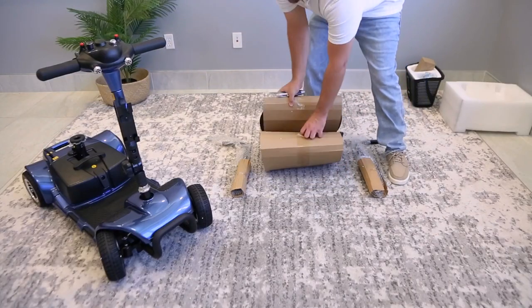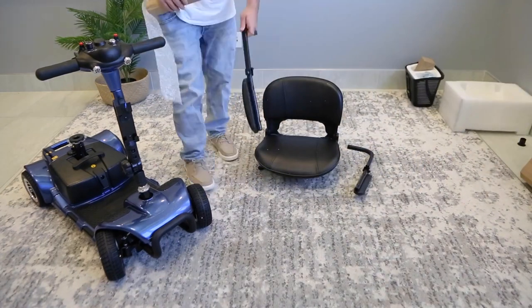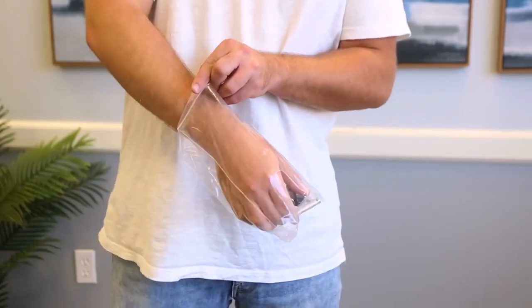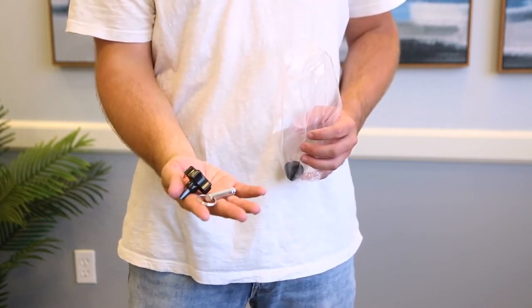Now it's time to put on the seat. Be careful when removing the tape and cardboard — you don't want to accidentally damage the cushion or armrests. Line up the bottom seat peg with the peg on the scooter and then set the seat in gently. In the basket with the manual, you'll see another bag with a star knob and pin. You'll need these for the next step: assembling the seat.